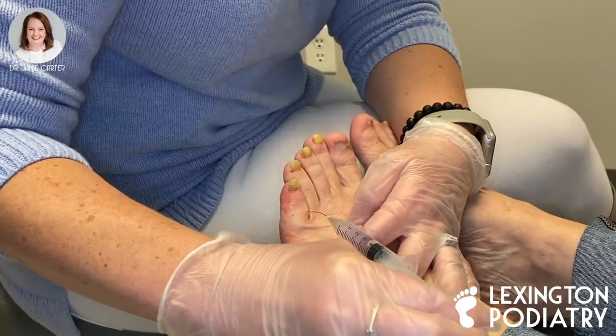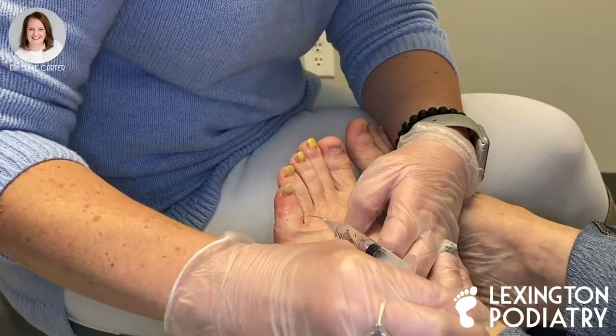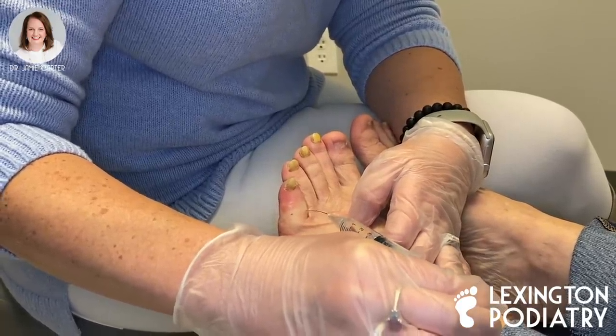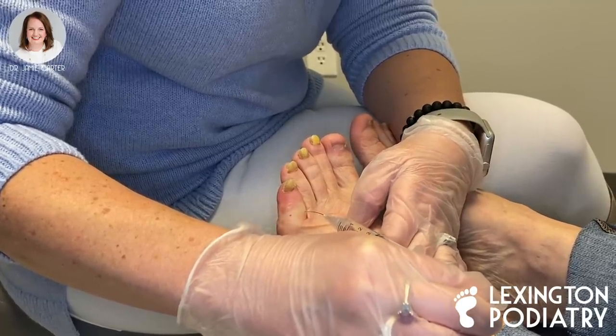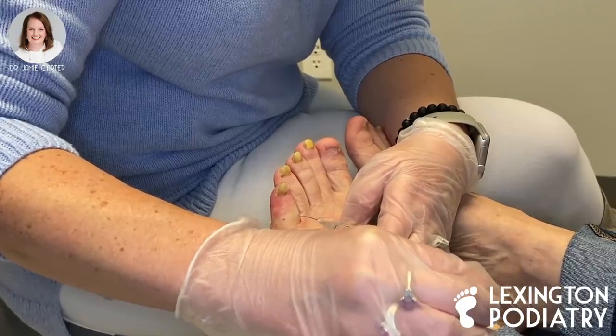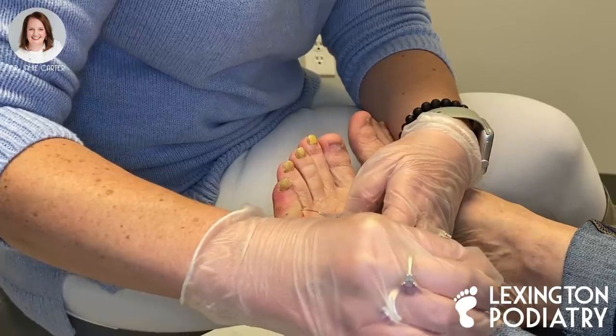Do you have any questions about the procedure? I don't think so. Good. When it's all said and done, we'll have you dress it every day. We use a collagen powder that we sprinkle in there. We have you soak it in an Epsom salt water solution every day. And where we put the chemical on you, it takes about three to four weeks for it to heal.